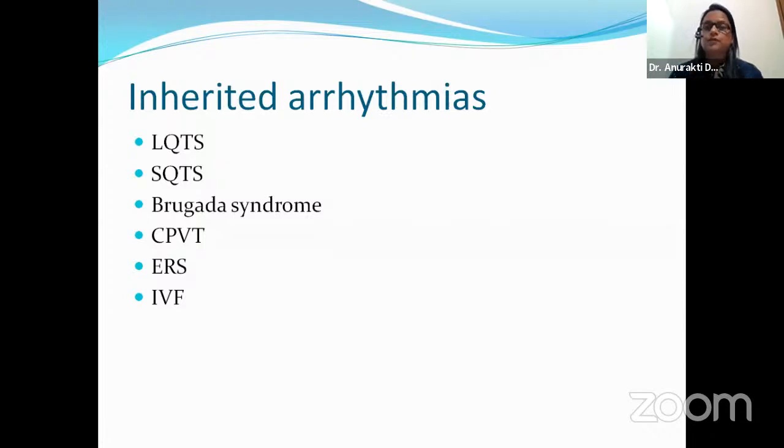And after that, when we did that exercise testing, we could not see any arrhythmia as such. But then we did something which is called a burst protocol, a newer exercise testing protocol, and he showed three ventricular beats altogether. And after that, it went on and on, and he had CPVT. So you never know when AECG, a continuous ECG monitoring, can help you, and what all it can give you if you have a proper history and physical examination, and you have back in your mind the diagnosis which you are searching for.